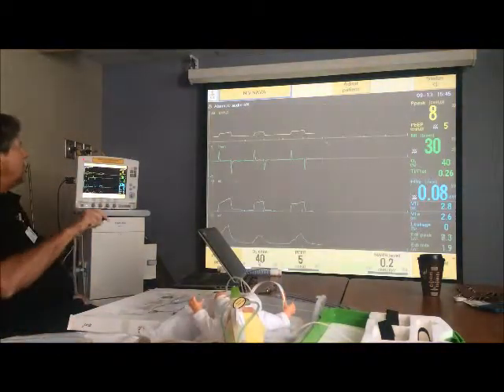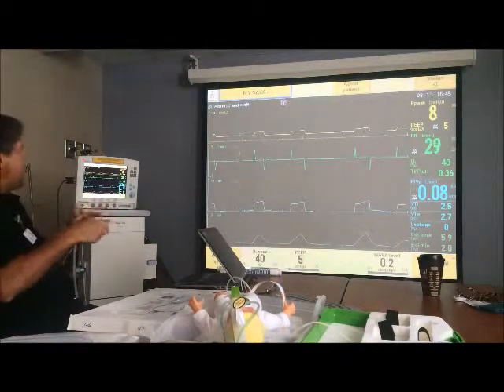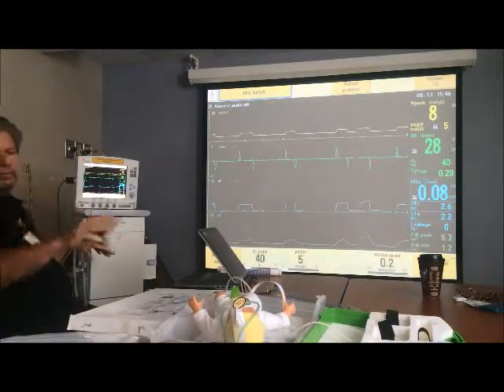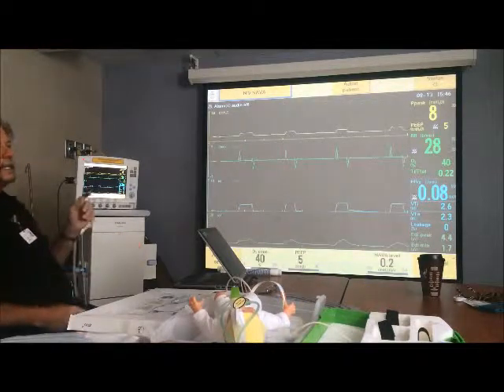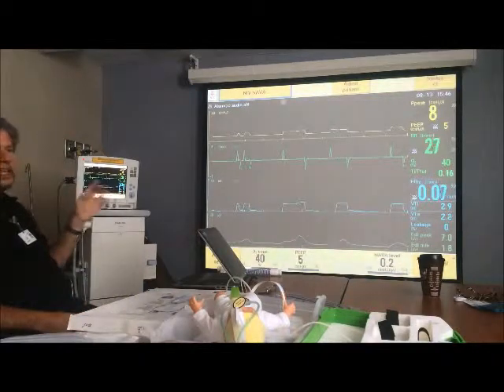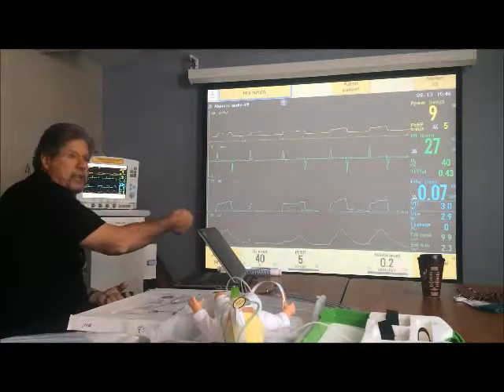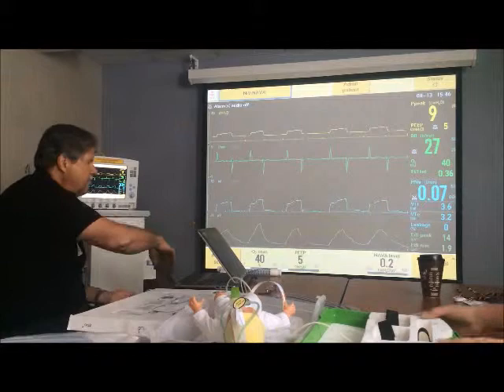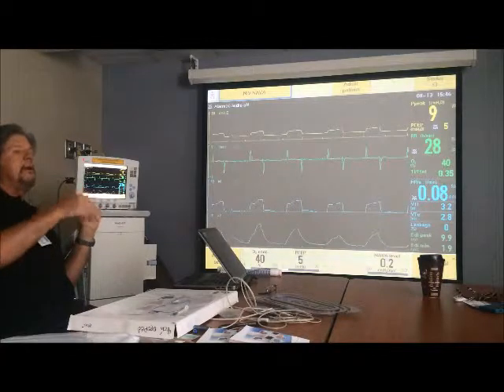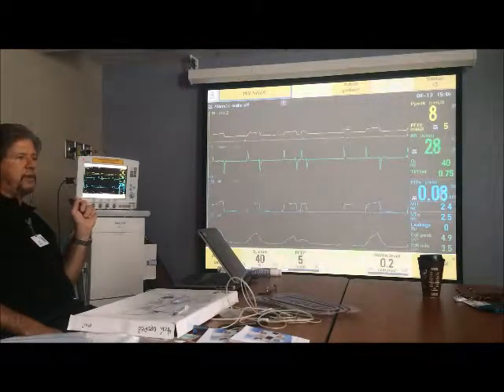But you're not using NAVA as a ventilatory tool because he's on 21% and he's getting essentially 2 centimeters of pressure support. He doesn't need ventilation at all through this system that you have. What he needs is, every time he went to backup, he desatted. So the ventilator is just flicking his heel. So all the discussion about, oh, if we want to make him breathe easier or breathe less, turn the NAVA level up or down, you'll never touch this NAVA level because all you're using it for is basically mimicking bubble CPAP, but now you have this sophisticated backup that goes to this backup and gives him a puff through the nose.